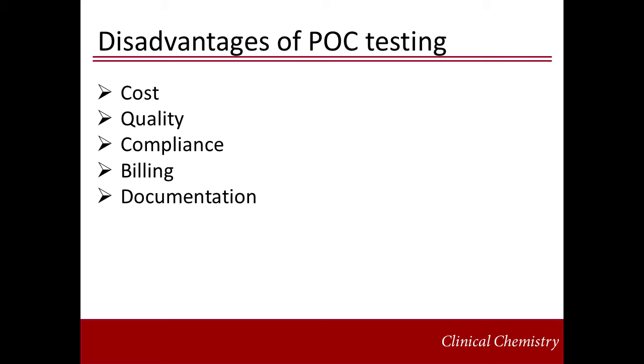Finally, all of these POC disadvantages require a strong link between the clinical staff and IT. Since IT is generally not familiar with the lab, and the clinical staff is generally naive to IT, they must work together to create a process for the point-of-care testing that limits these disadvantages.